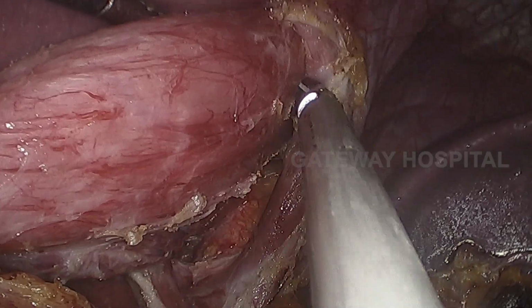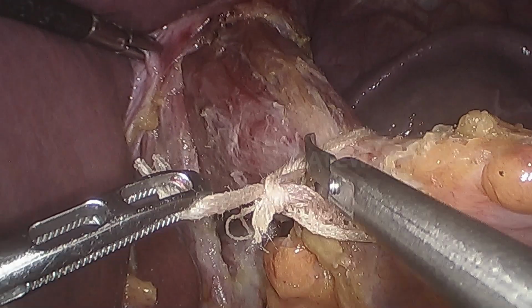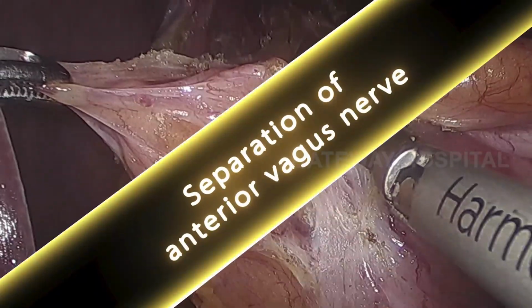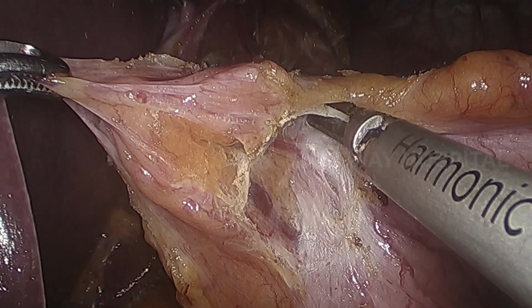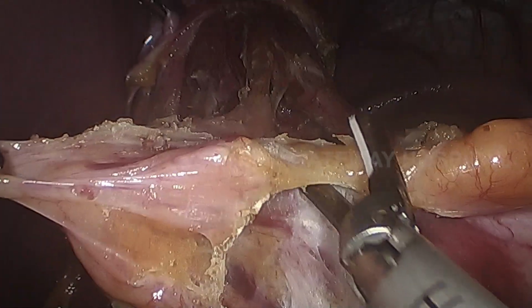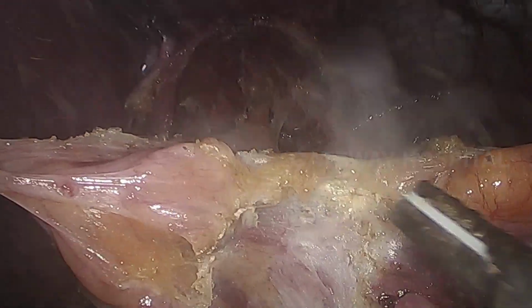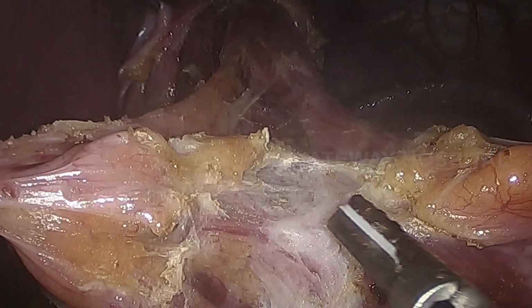The entire left crus is exposed and all the attachments are released between the left crus and the esophagus. After complete mobilization, we divide and remove the umbilical tape, and this step is done in order to separate the anterior vagus from the esophagus. Normally the anterior vagus runs from left to right across the lower third of the esophagus.